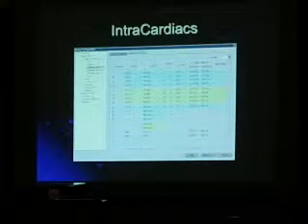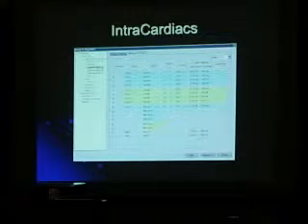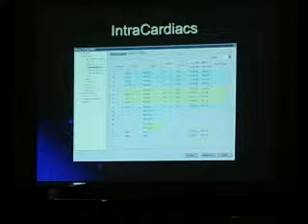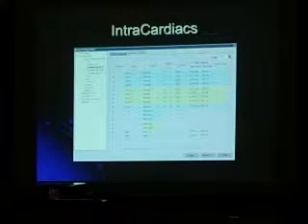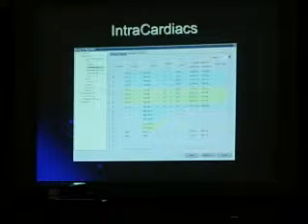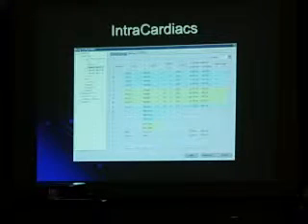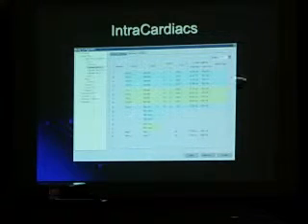And that makes it really nice because that fixes that intracardiac signal right at the isoelectric line so it's not wavering all over the place. If you're ever looking at a signal and it's going like this, all over the screen, somebody didn't set their high pass correctly. They've got it at like 0.05 or 0.5. So we want that at 30.